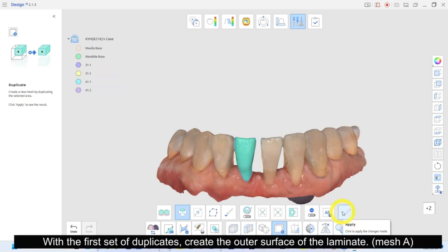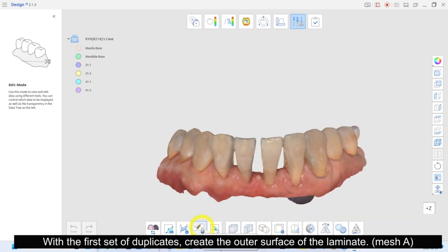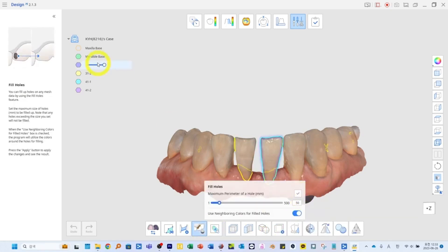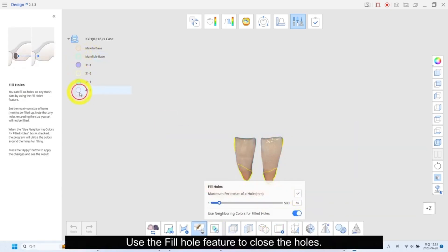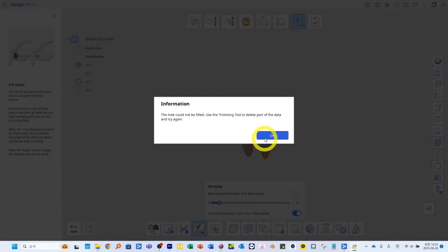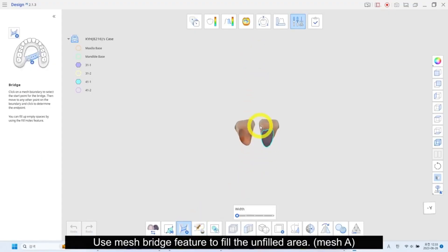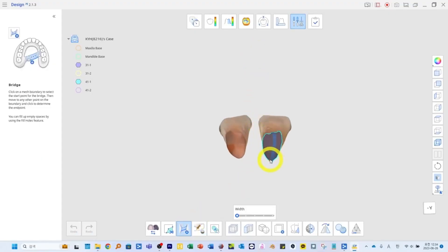With the first set of duplicates, create the outer surface of the laminate. Use the fill holes feature to close the holes. Use mesh bridge feature to fill the unfilled area.